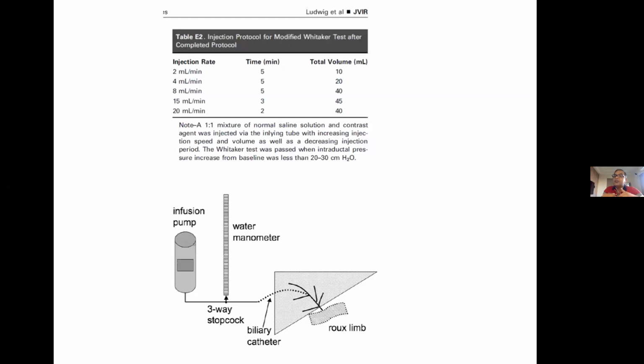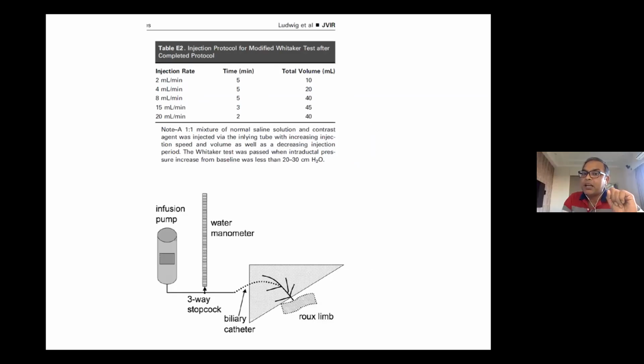You place the multiple stents, wait for 9 to 12 months, the remodeling will occur, and you see the contrast is not passing on the cholangiography, but actually the patient has no symptoms and there is good clinical improvement. So what's the best way if we are not getting a clear-cut idea of how effective my treatment is? The best thing to do is the biliary manometry.